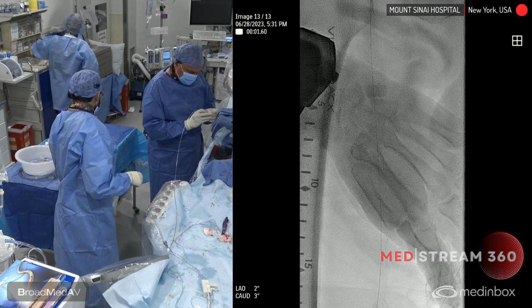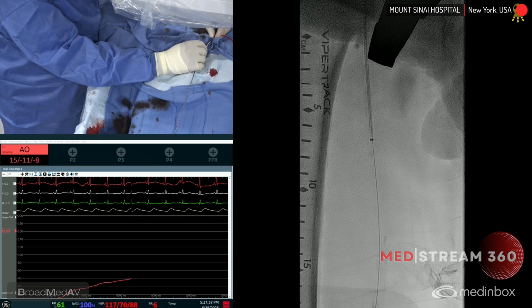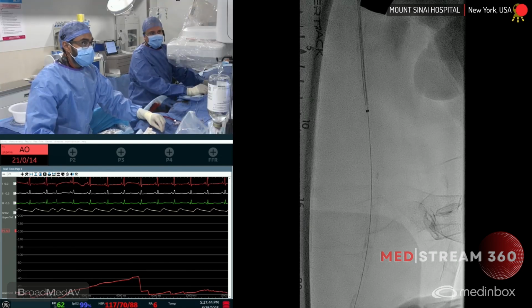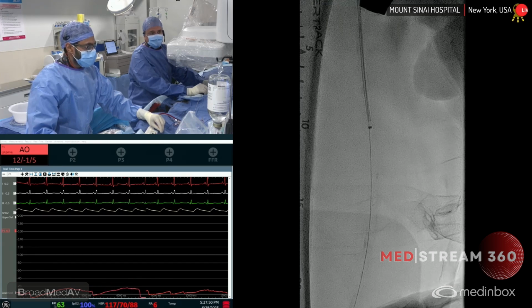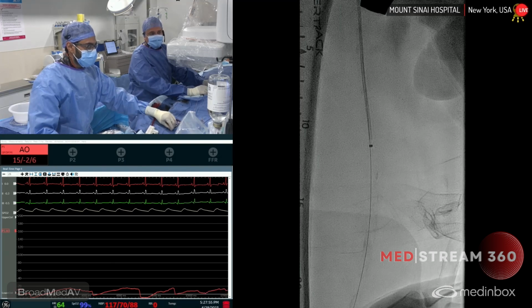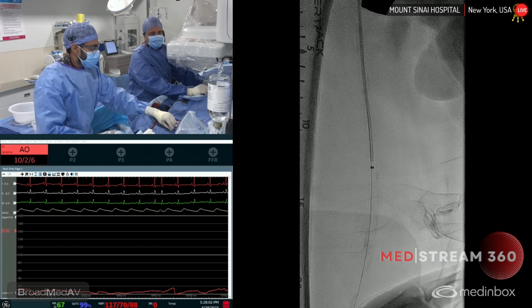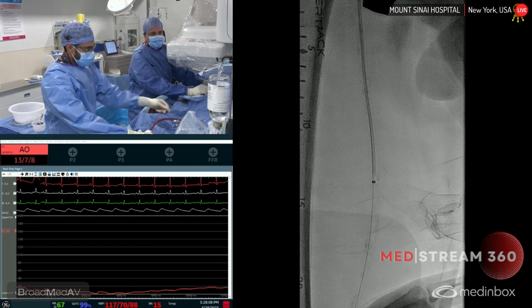So we're going to run this through. We're just going to do this slow aspiration of the lesion. Let it do the work. It doesn't aspirate straight blood, and because of that, it's going to look like you have a lot of blood inside the container. It's about two-thirds to one-third, I guess, saline to blood. So therefore, it's really the technique of aspiration that's very, very important. So you can see here we're going very, very slow and allowing the catheter to do the work and really allowing the catheter to suck all the thrombus out.